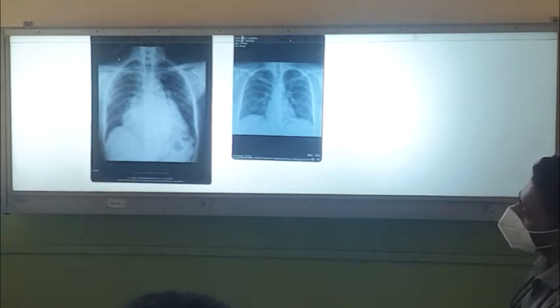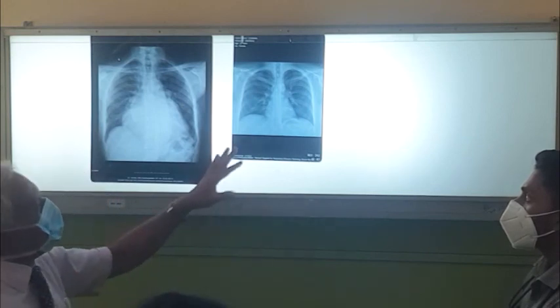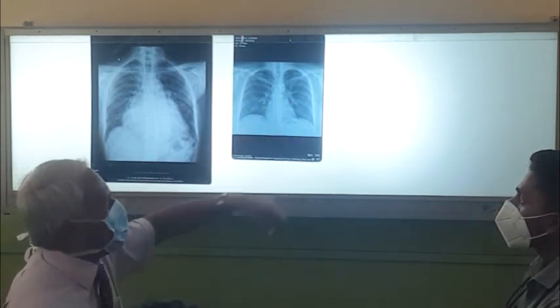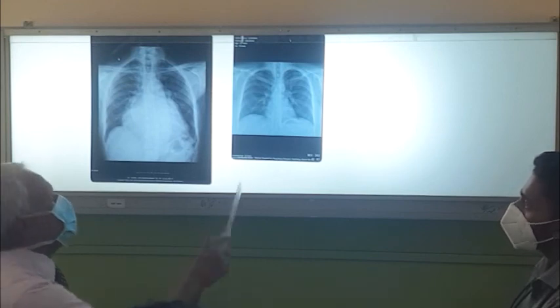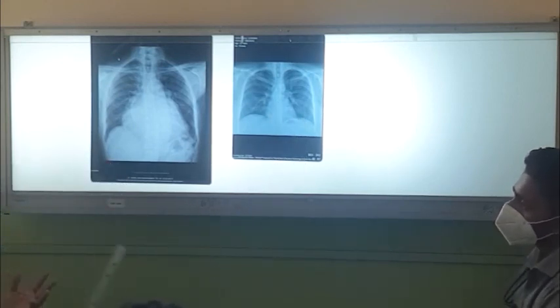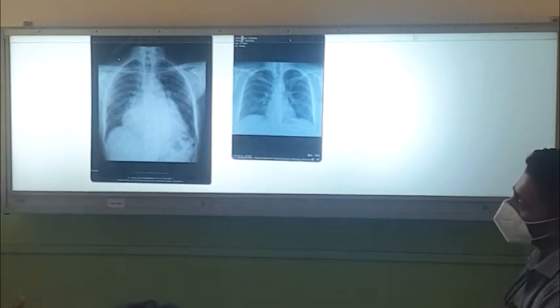So I didn't talk about these cardiac appearances. So when you do your cardiology appointment, learn about different patterns in the heart, right? What happens in hypertension? You get a globular dilated left ventricle, right? In tetralogy of Fallot, you get something like a boot-shaped heart, right? In coarctation of the aorta, you get rib erosion in the fourth and fifth ribs, counting on the left side, right?